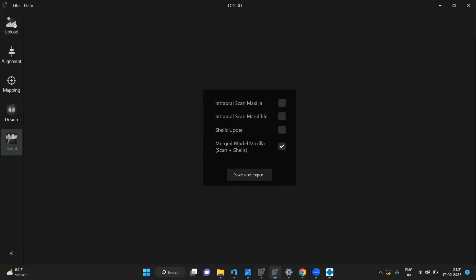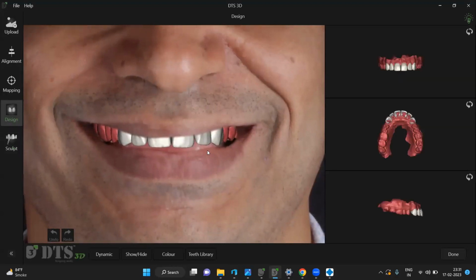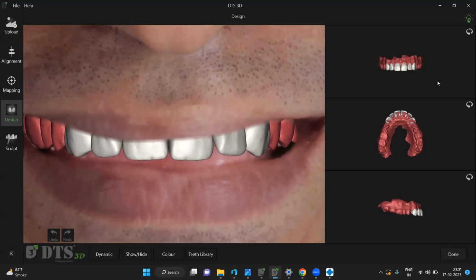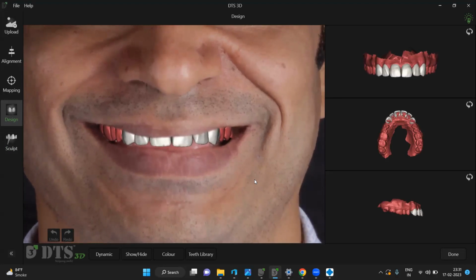So that is about it on the basics of how do you use the DTS 3D software. I hope the webinar has been a useful experience for all of you. If you have any doubts, if you have any questions, you can just put them across on email and we will be more than happy to solve them as and when needed. There will be continuous updates and upgrades with the DTS 3D as well as the DTS Pro software. So we hope it becomes a part of your routine day-to-day practice.